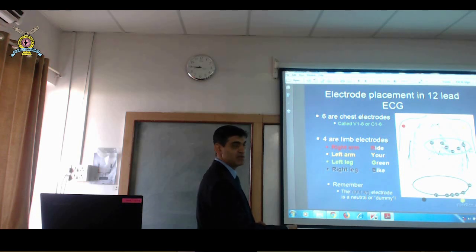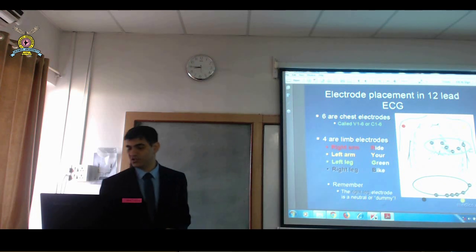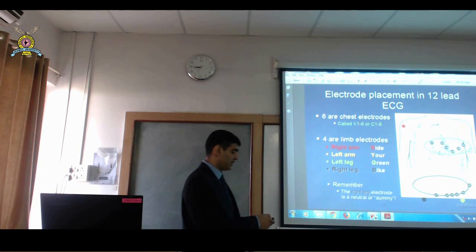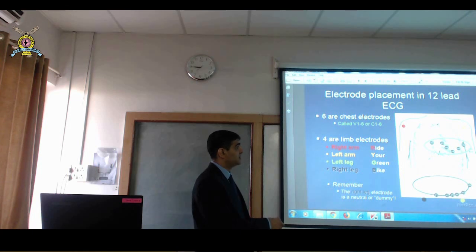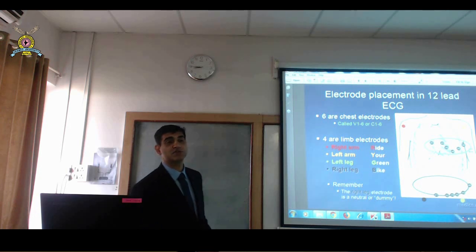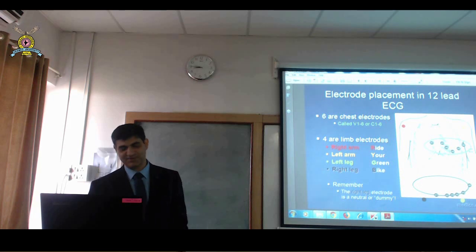So V3 doesn't have any specific intercostal space. It's just between V4 and V2. So if it is between fourth and fifth, then it is somewhere in between, V3. And then V5 and V6, where is the V5, V6 position? Anterior axillary line. So that is V5, right? V5 is anterior axillary line. V6, mid axillary line. Which intercostal space? Fifth. Very good.